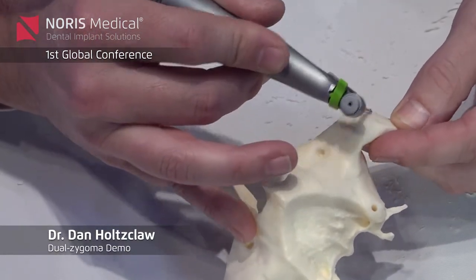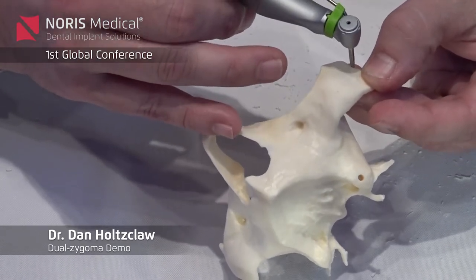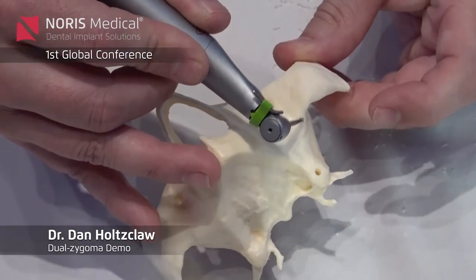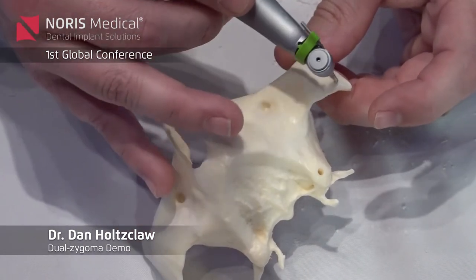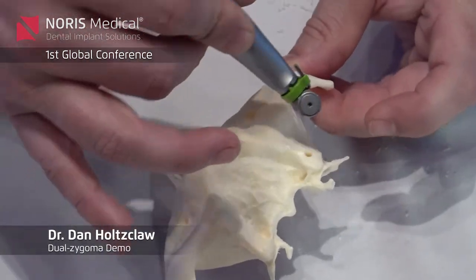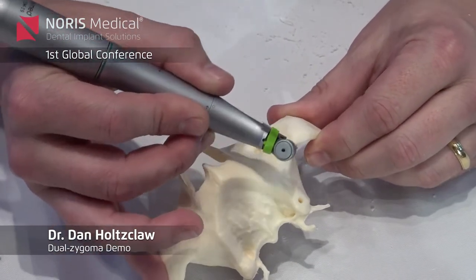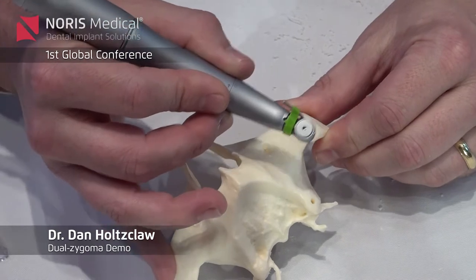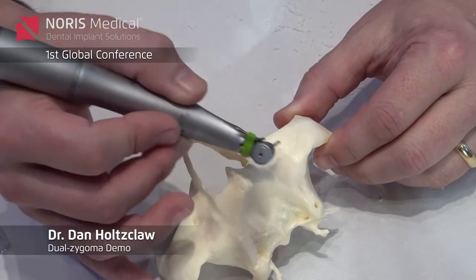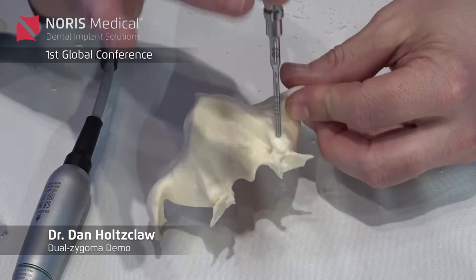You're going to elevate the tissue all the way until you drop into the zygomatic notch, which is way up here. What I'm looking for is to follow the buttress up until it starts to become the zygomatic arch. I'm going to reflect as much as I need to so I can see the base of this. If I don't see it and I've reflected as much as needed, I'm not going to dig around and look for it — I'll always put the pterygoid in first.